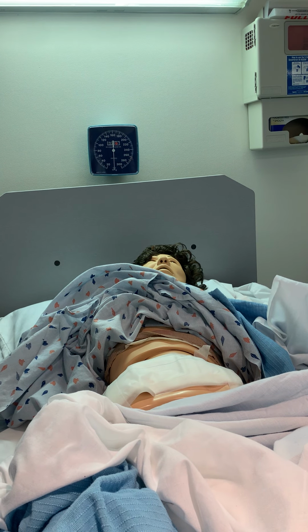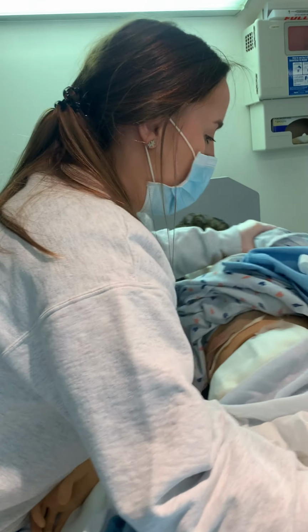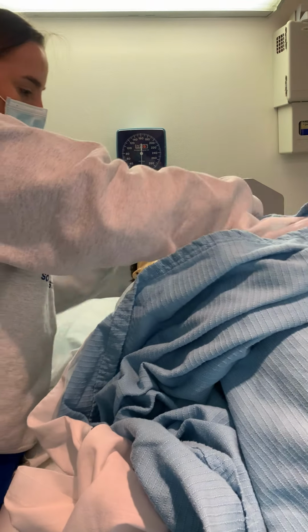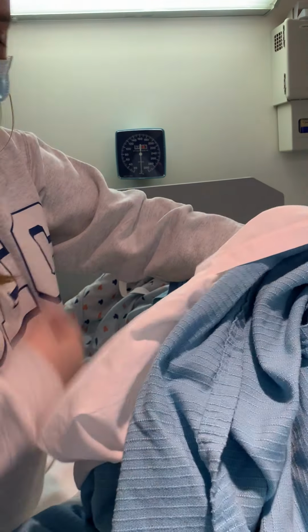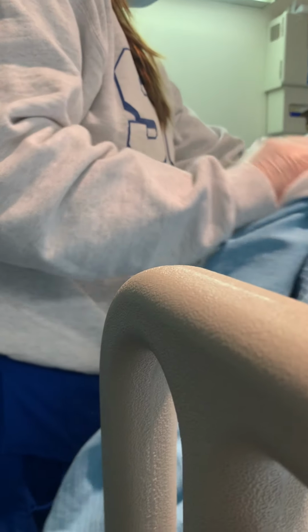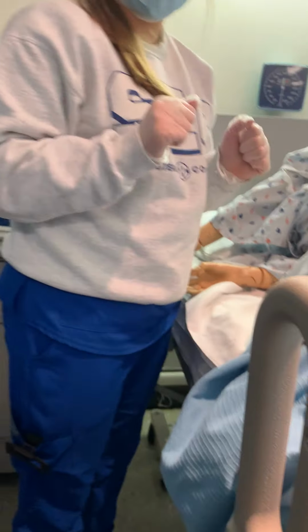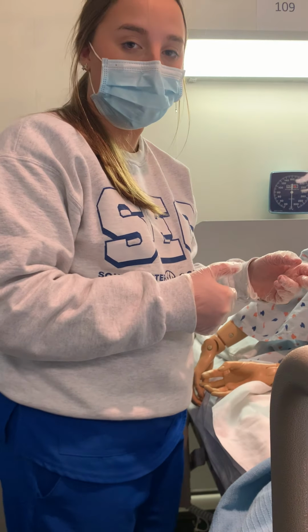Miss Smith, we're going to turn my way, okay? Now that I have my patient moved, I am going to start taking off the bandage, working my way to the midline of the wound, and being very gentle.